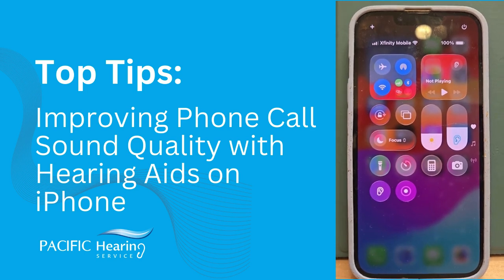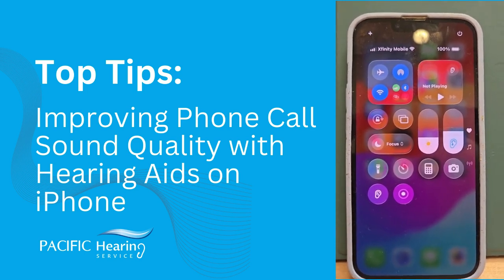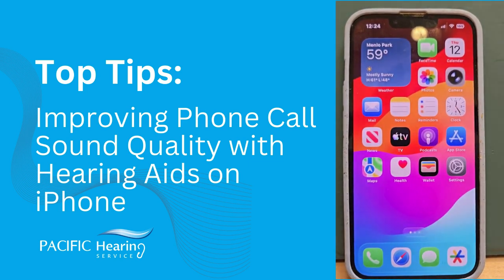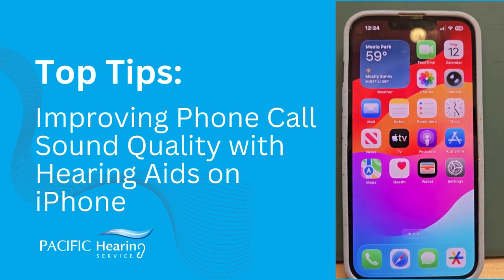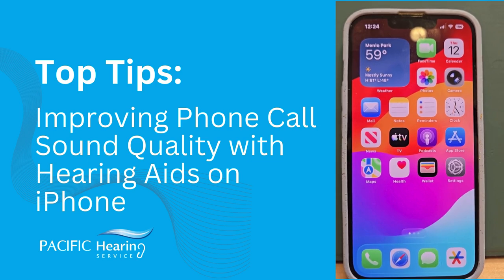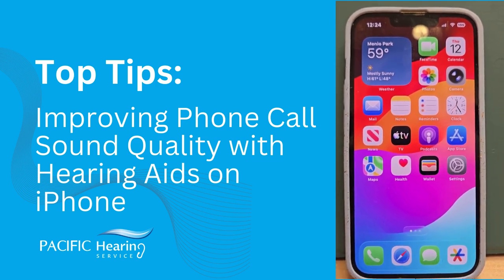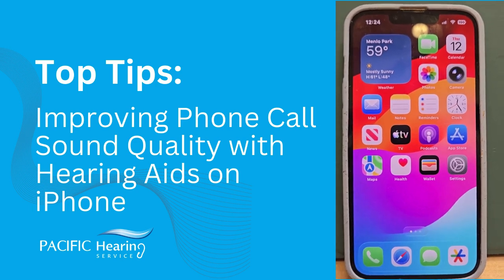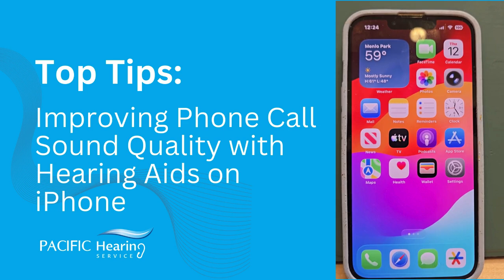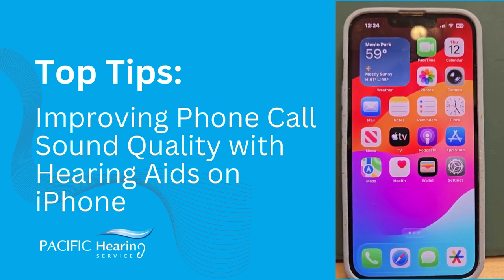Today I'm going to show you how to change the microphone input on your iPhone. When the hearing aids are connected to your iPhone, some of the hearing aids are picking up your speech when you're on a call. And sometimes people on the other end of the phone conversation will say something like, "You don't sound very clear," or "You sound like you're in a tunnel." So what we want to do is change the input from microphone that's going into the phone from the hearing aids back to the iPhone.